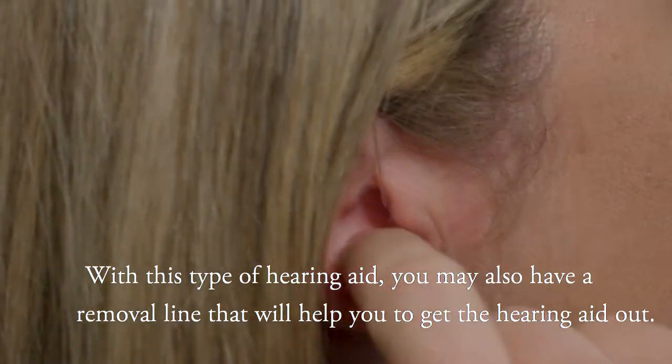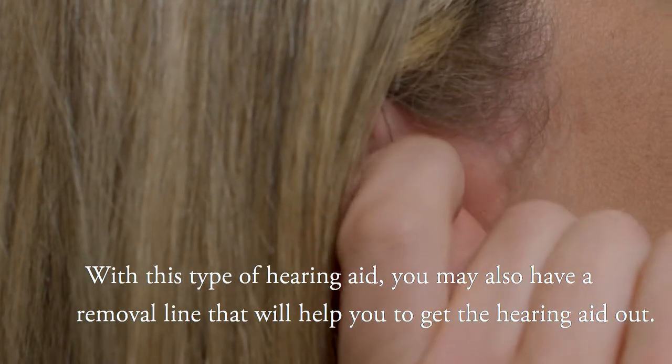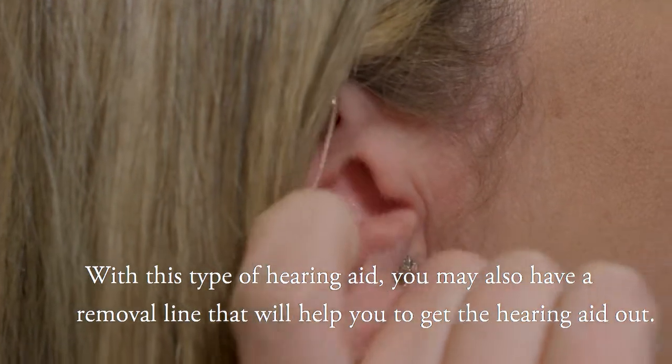With this type of hearing aid, you may also have a removal line that will help you to get the hearing aid out.